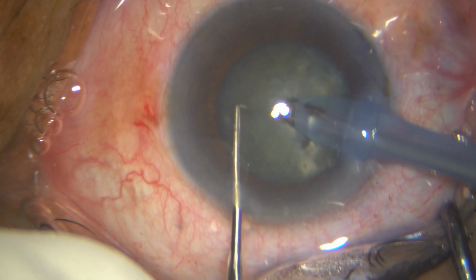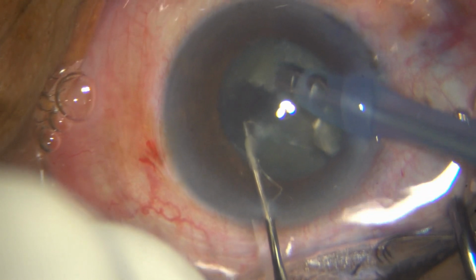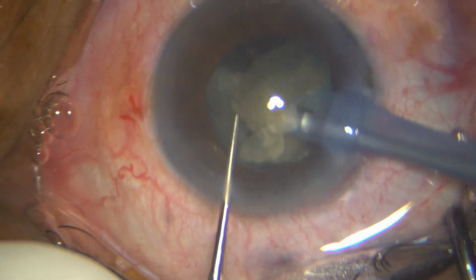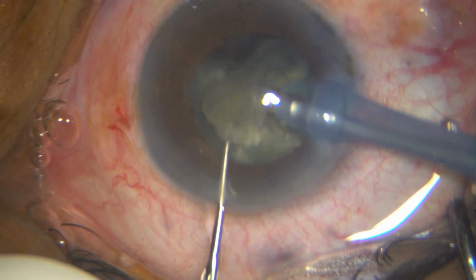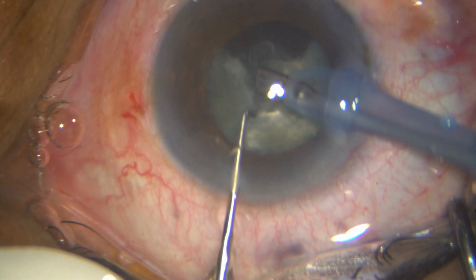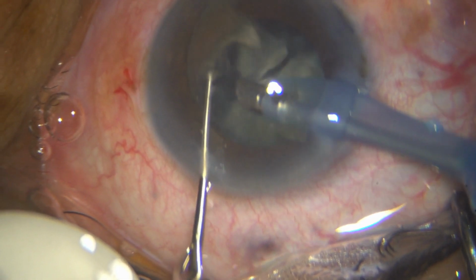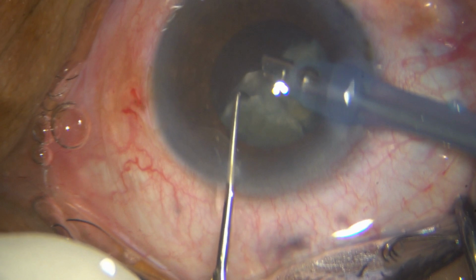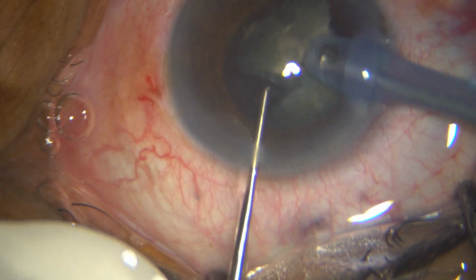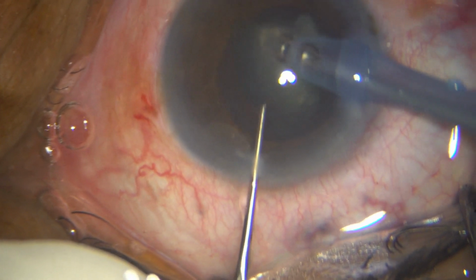And this case is a pretty simple case, frankly. So once I've got 4 segments, I think that's enough. I start eating up the segments. I am at the same parameters, mind you, I have not changed anything. Pupil is not small, but it's mid dilated. And there comes the last segment also.